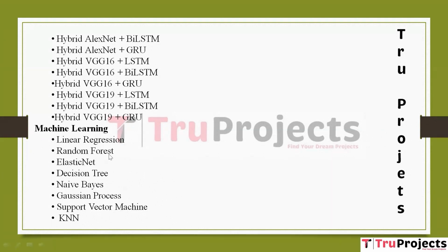Random forest. Random forest is an ensemble learning method that consists of multiple decision trees. It's particularly useful for both classification and regression tasks. In this project, it can be applied to analyze feature data from ECG signals and make predictions about sleep apnea. ElasticNet. ElasticNet is a regression algorithm that combines the properties of both L1 (lasso) and L2 (ridge) regularization. It's used when there are many features and it helps prevent overfitting. It can be used to analyze feature data for sleep apnea prediction.